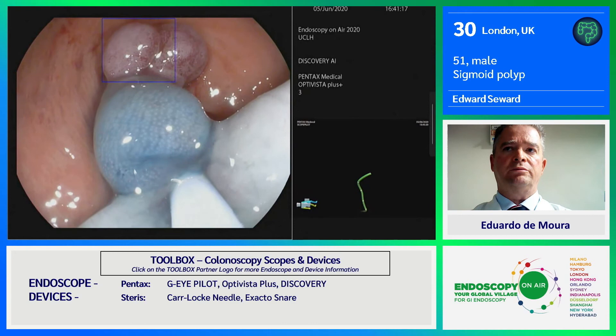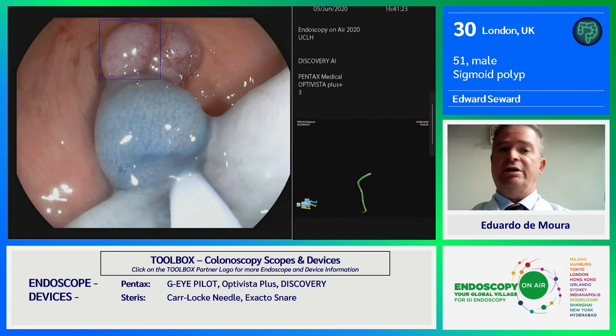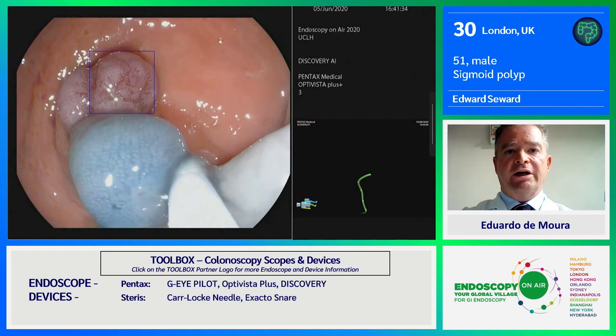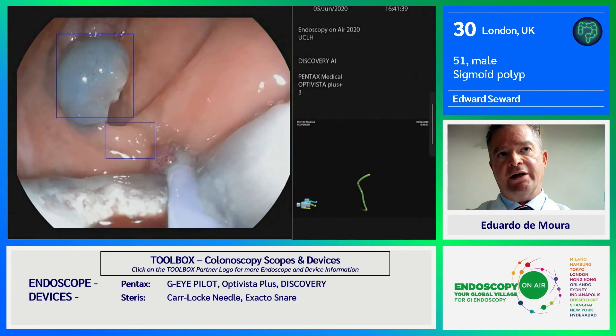When you're removing a large-ish pedunculated polyp like this, you need to try and give your histopathologist plenty of stalk, just in case there's extension down the stalk. So we're just going to remove that now and then go back to room two. Excellent — resection complete.